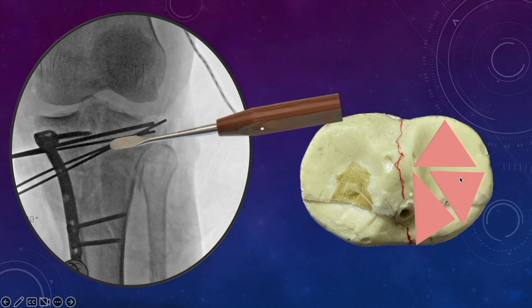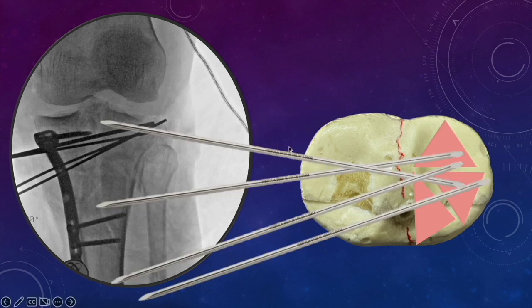So this is the pictorial representation of the multiple depressed fragments. Our periosteal elevator is actually a wide instrument which is lifting most of the fragments to the proper location, and we can fine-tune lifting of those fragments with multiple fluoroscopic views. And once we are satisfied with the alignment, we have to pass the K-wires from the medial to the lateral side to keep the fragments locked in that particular position. So our K-wires will be going from this part to this part, and they are going to lock the depressed fragments in a reduced position.